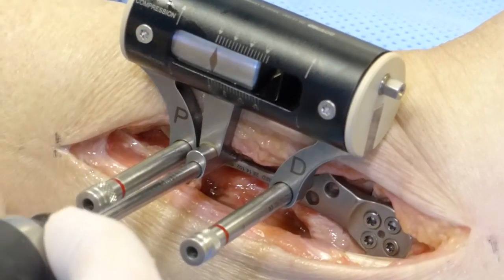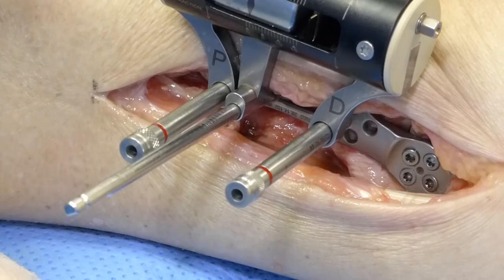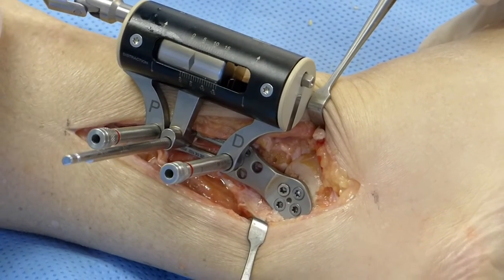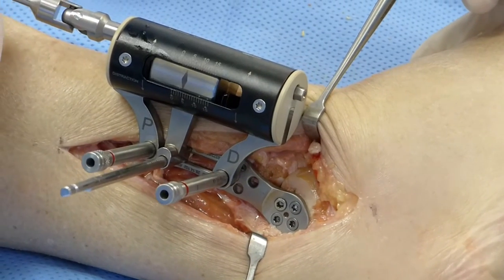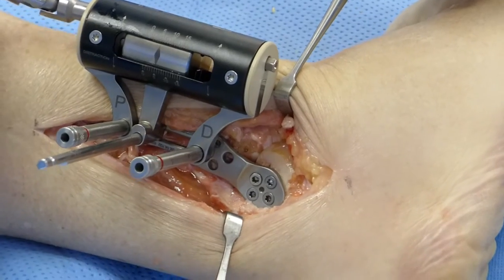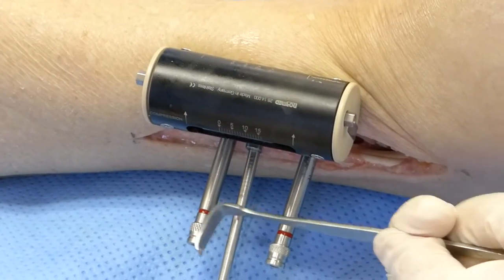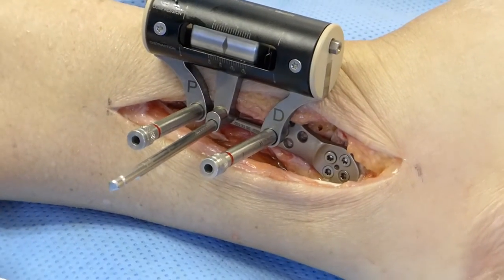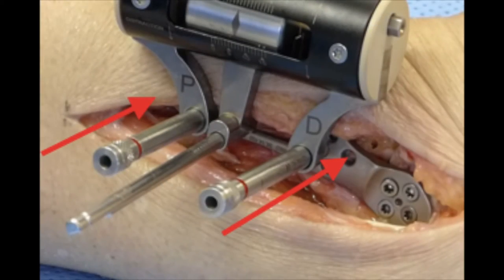This has best purchase when passed through both cortices of the tibia. By turning the side bolt, compression is applied. The degree of compression is gauged by feel and surgical discretion. Screws are applied to the plate through accessible and vacant screw holes to maintain the compression before removing the external compressor.